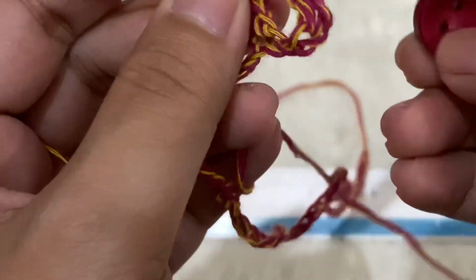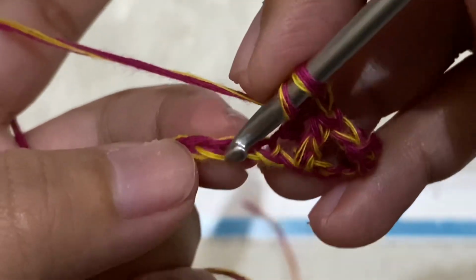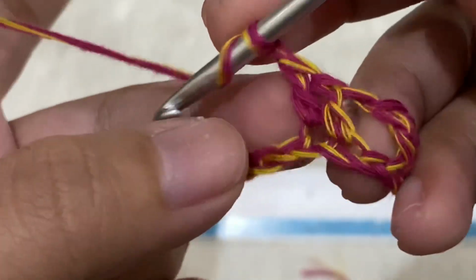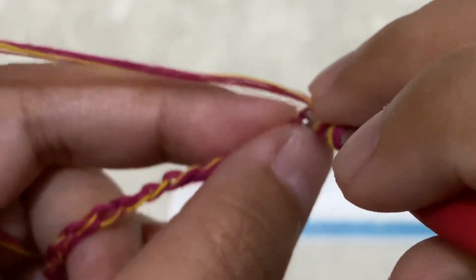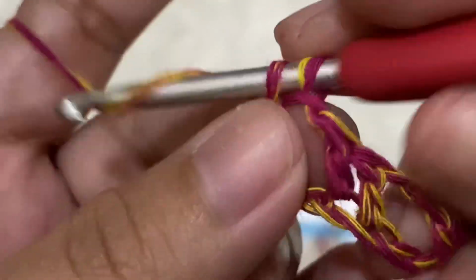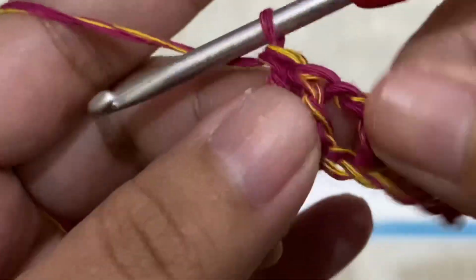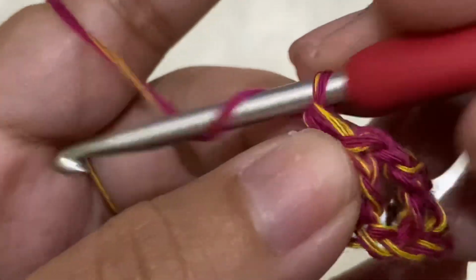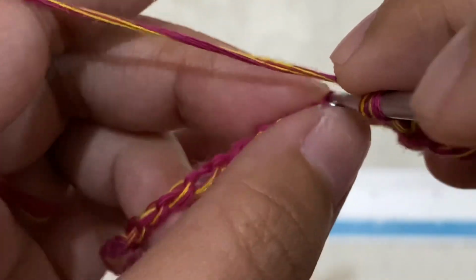Okay, if you will be using a bigger button, you can try to see if it fits in that one chain space, but if it doesn't, maybe you can try doing 2 chains and then skipping 2 stitches from your chain foundation. So just keep repeating this pattern. So chain 1, skip 1 stitch from your chain foundation, and then double crochet on the next 2 stitches, and so on. Okay, until you reach the number of spaces or buttonholes that you want to have on your ear saver. For me, I stopped at 10.